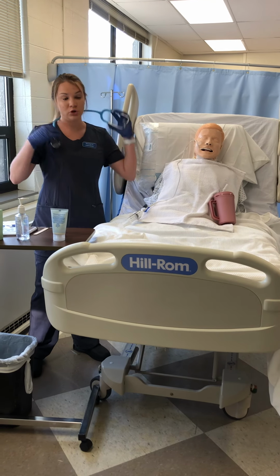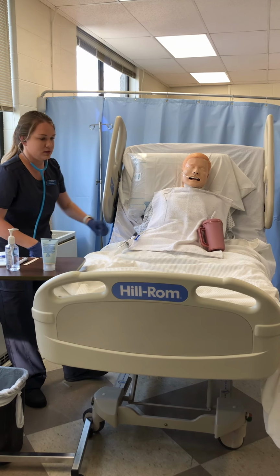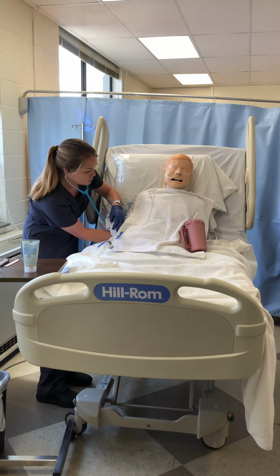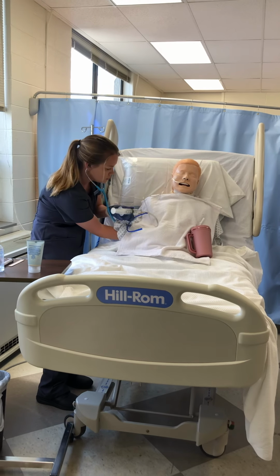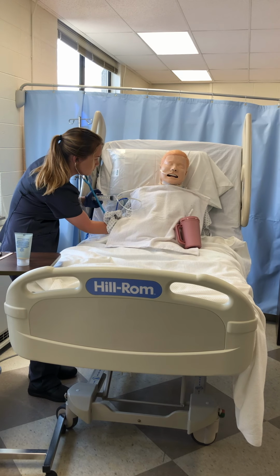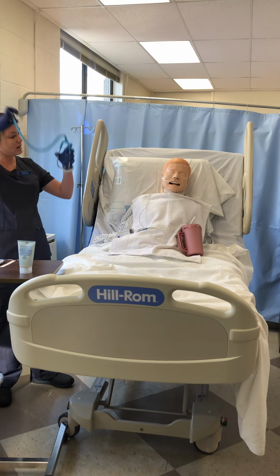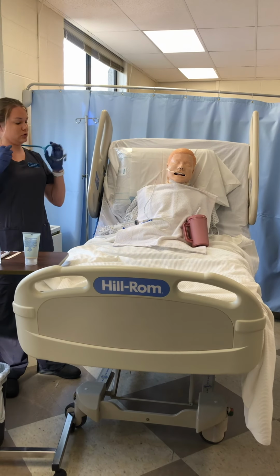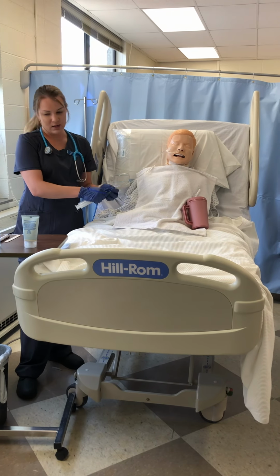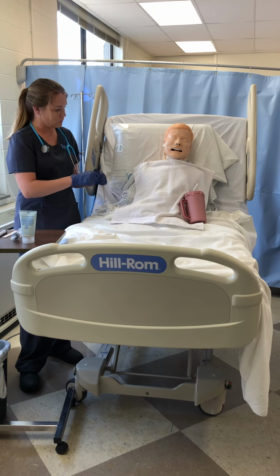Now I'm going to push air in to check placement. I'm going to listen over the xiphoid process. I should hear a whooshing sound, which I do, so I know I'm in the right place. And then if you're unsure, an x-ray is always the best way to know if you're in the right place.